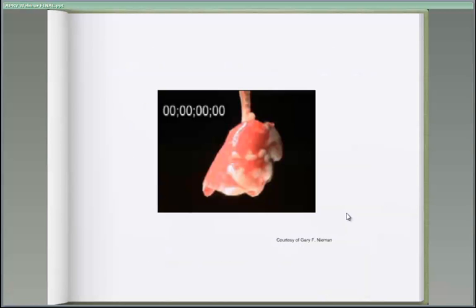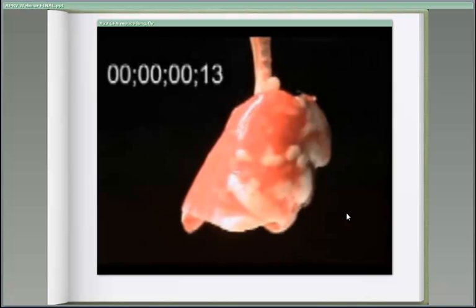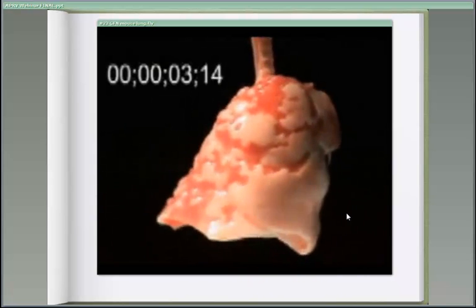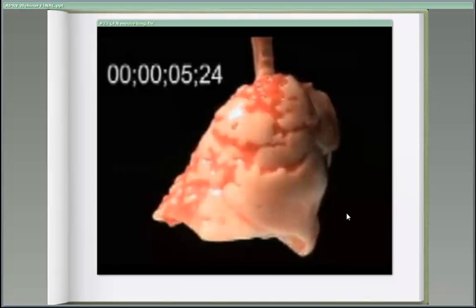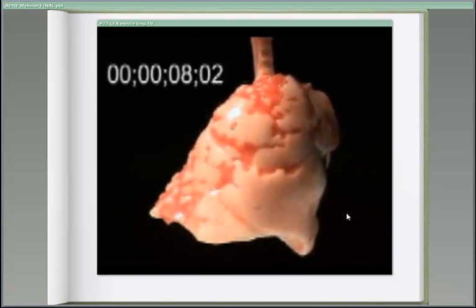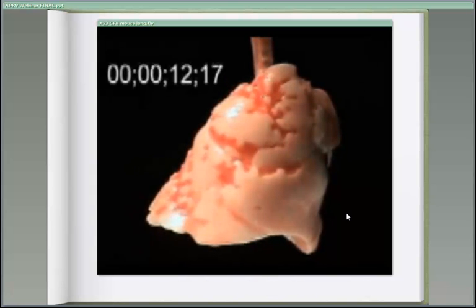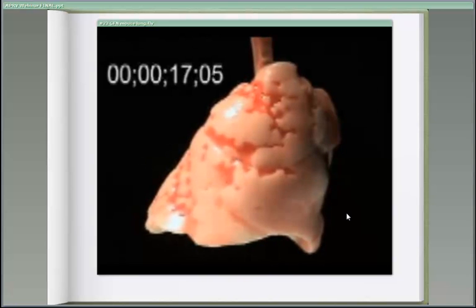Now, back to the airway profile. The airway profile of having a near continuous pressure really is a function of how the lung behaves to inflation. And if you just look, as you hold pressure, the lung continues to recruit and it becomes stable. In fact, it takes a significant amount of time for the lung to stabilize. As the lung gets more stable and as the alveoli get more stable, this may actually be beneficial in preventing or limiting the ventilator contribution to lung injury.